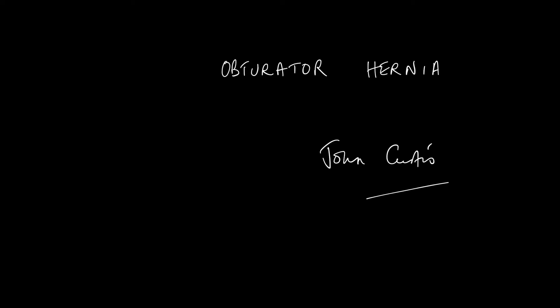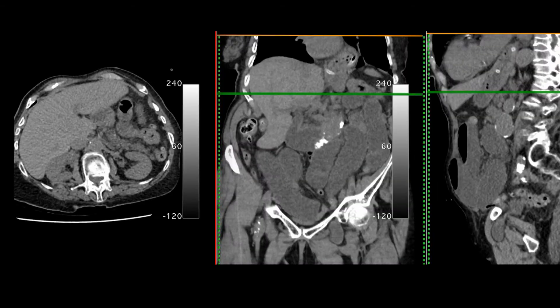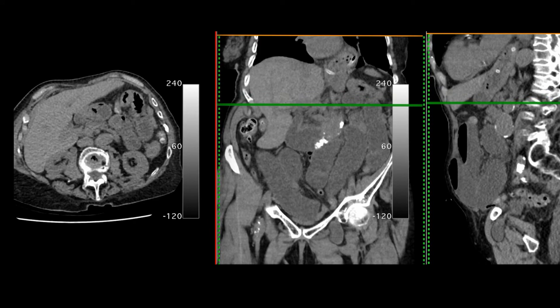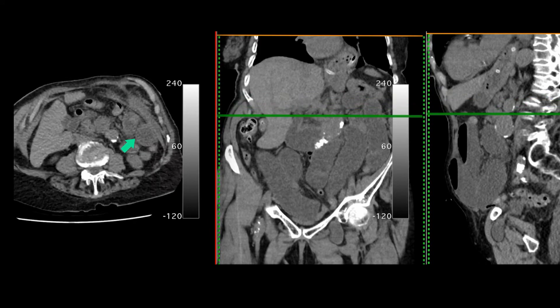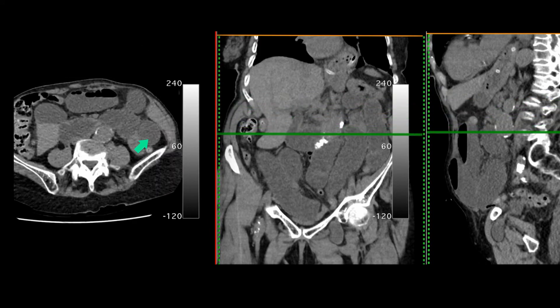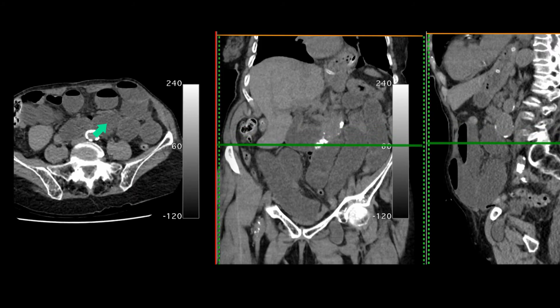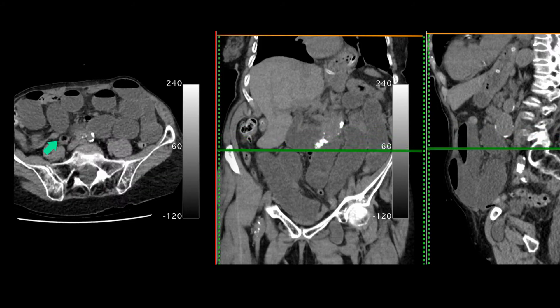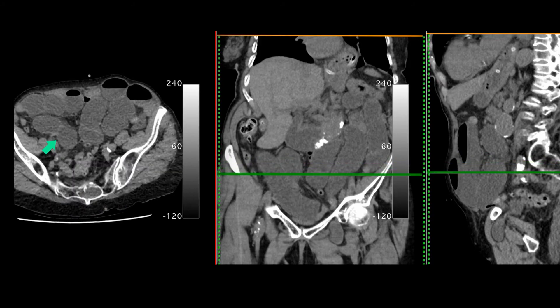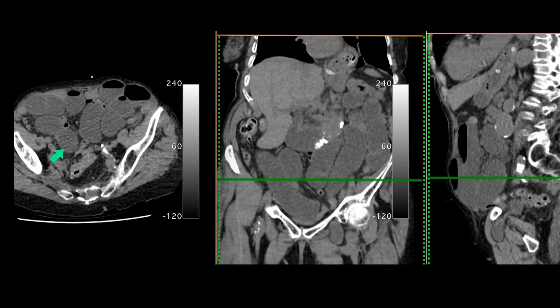In this video I'll be discussing the radiological and clinical aspects of an obturator hernia. This is an elderly female who presents with abdominal pain. You can see that there is small bowel dilatation and there is a calibre change where you've got normal calibre small bowel. So we know that this is a mechanical obstruction.